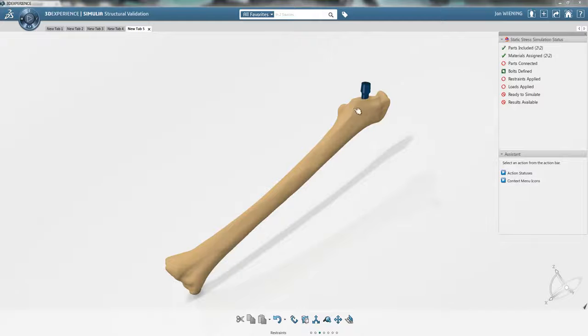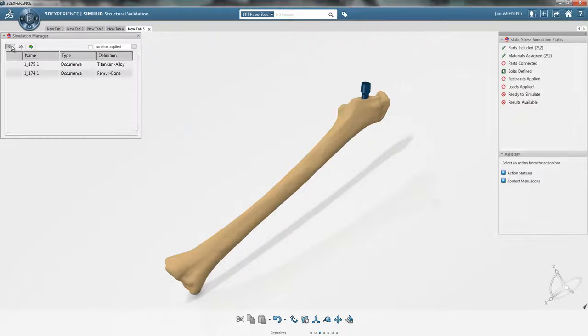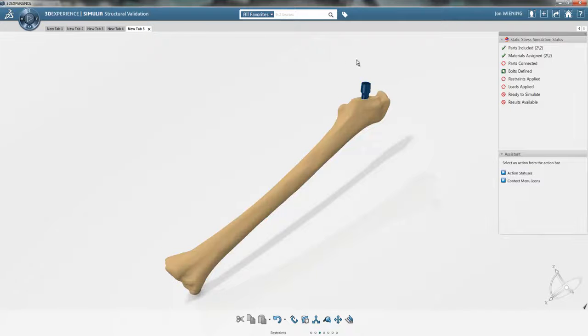We have two parts. There's both the bone and the implant. Materials have already been assigned to each of these components. You can see that the implant has a titanium alloy material, the bone has a bone material. The parts are not yet connected, so that will be our first step in setting up the simulation.